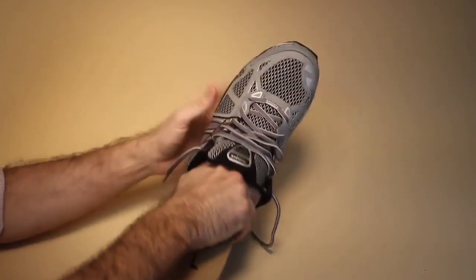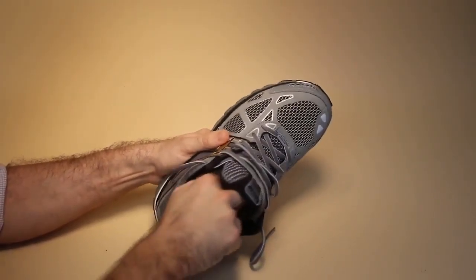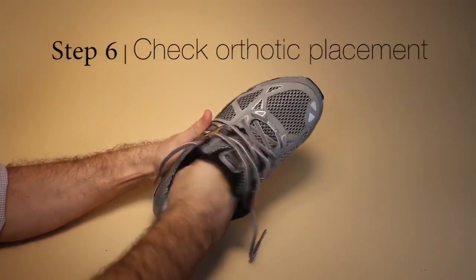Push the orthoses into the shoe. Keep the toe of the shoe pointed up so as to keep the heel lifts placed properly in the back of the shoe.